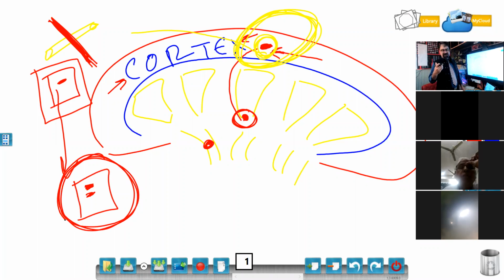So the basic important point is, if I don't know anatomy, I cannot make out all these things. Now, if this is a calculus, there is about a 98% chance that this pyramid will be dilated.